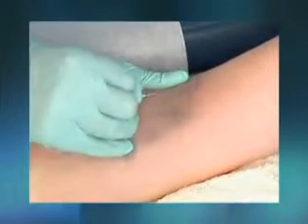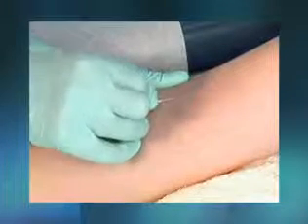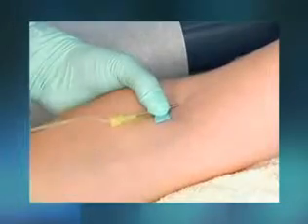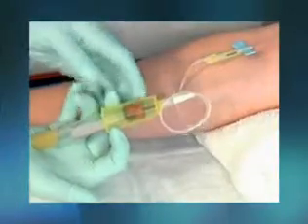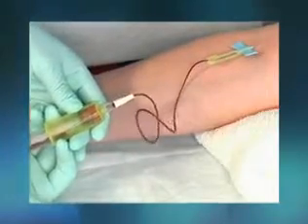The butterfly method for performing a vena puncture is used for difficult draws, such as when a vein is small or sclerosed. The medical assistant will show you how to collect venous blood using the butterfly method. The specimens will be transported to an outside laboratory for testing.